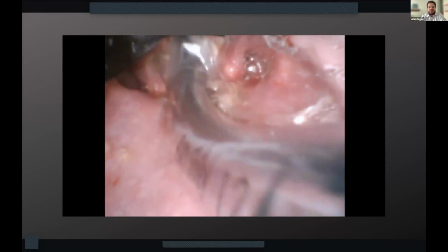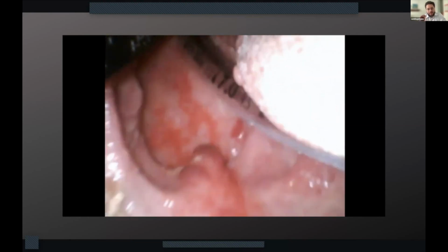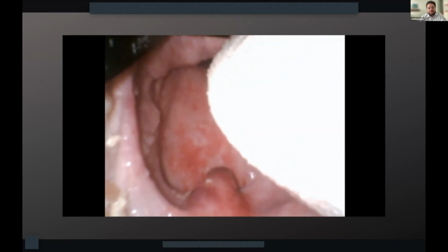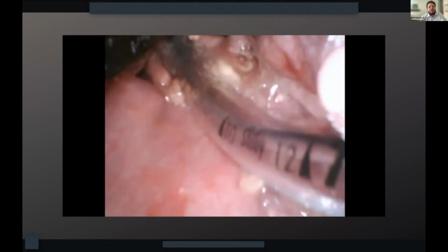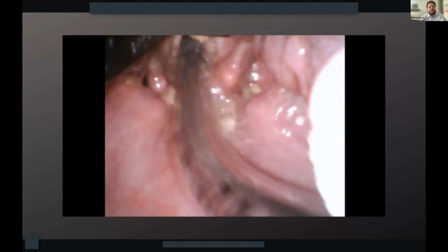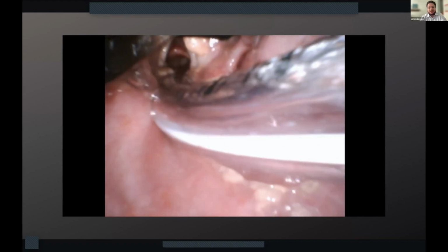Eventually, we do get it in the anterior portion of our view. But again, we have a little bit of a hang up and we don't actually see the balloon go into the trachea. We see it just in front of the vocal cords. Now they notice this as well, so they go back in, and here you'll see the rigid stylet come out. The rigid stylet is coming out, and now your ET tube is able to progress, and we have a successful intubation.